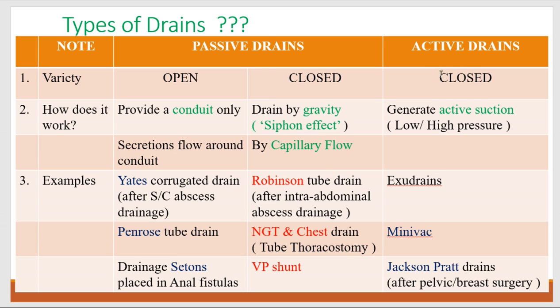Then the third one, the active drain, the closed variety. Example: the mini vac used in various plastic surgeries, and Jackson-Pratt drains after pelvic or breast surgery, right?